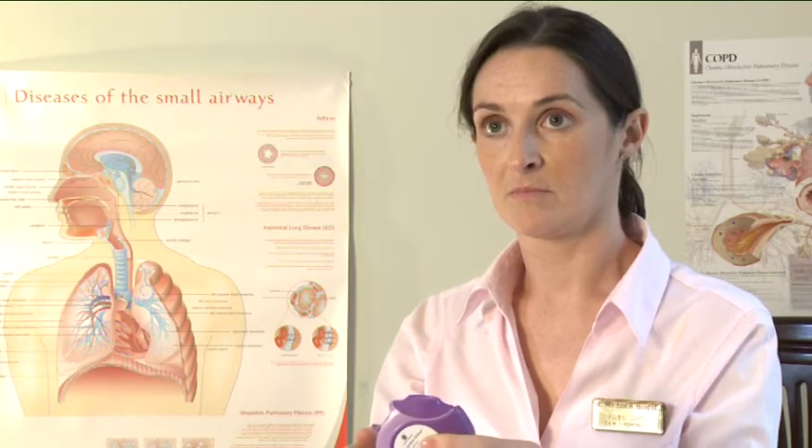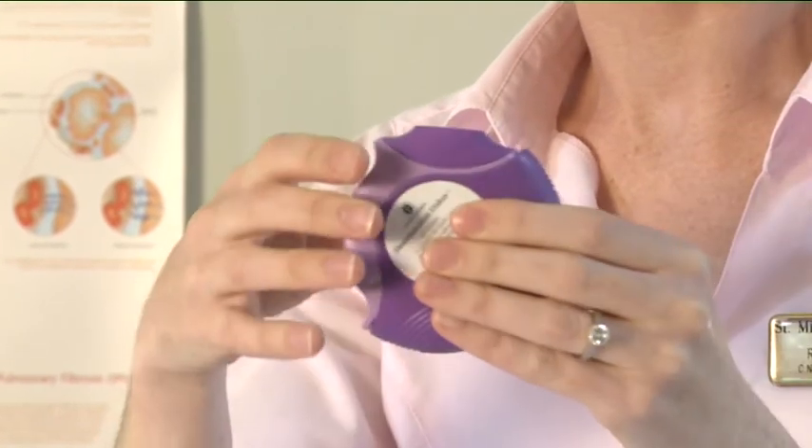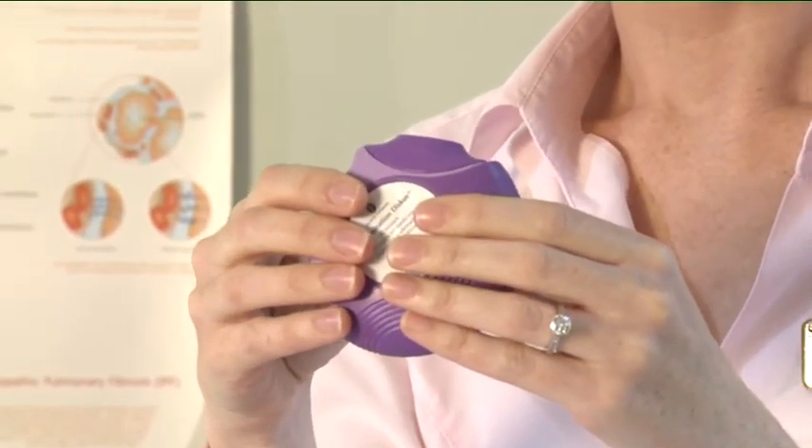Hold your discus with the mouthpiece towards you. You can hold it in either your right or left hand. Slide the lever away from you as far as it will go. You will hear a click. This places the dose of your medication in the mouthpiece.